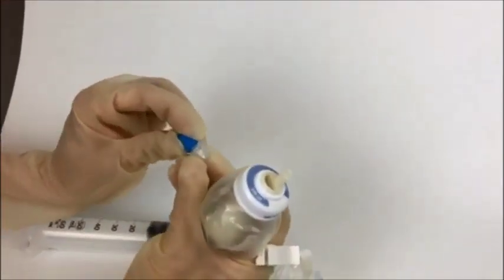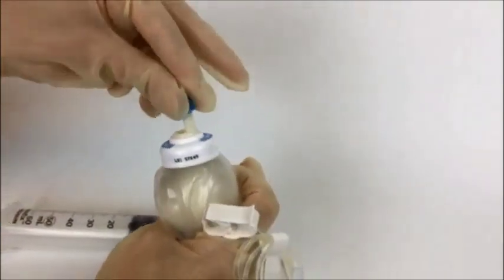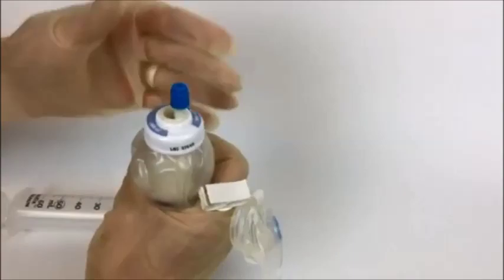Next, remove the disposable protective port cap from the sterile color-coded fill port cap, then attach the color-coded fill port cap to the filled SMARTeZ pump.